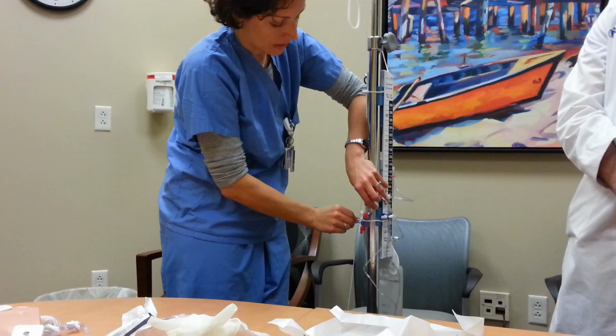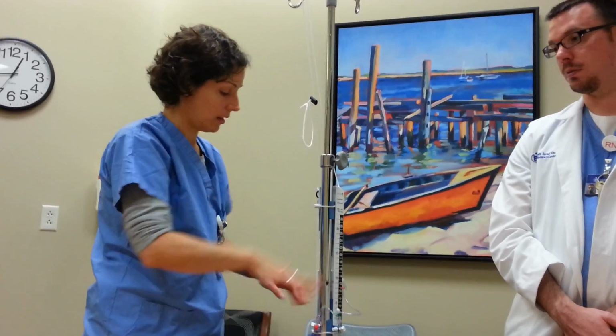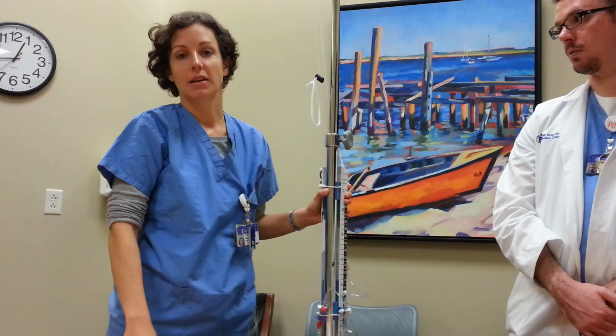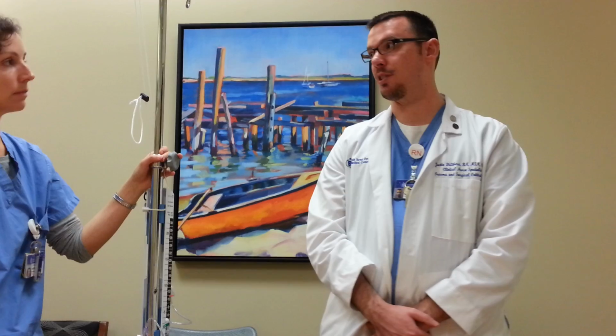It may be quicker and more time efficient to do it that way than to cumbersomely try and put the level of the drain up and down related to the patient's head. Great. And it is important, if you do decide to do that, always make sure you're putting the transducer back on the pole with the EVD.